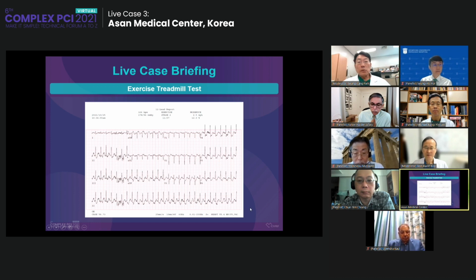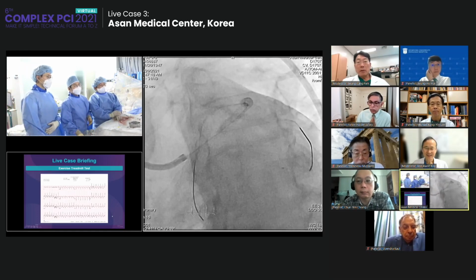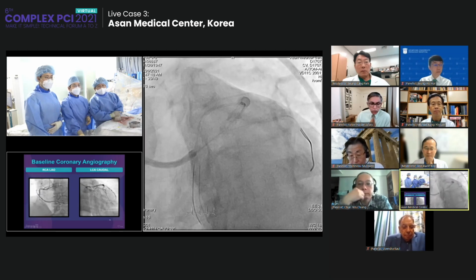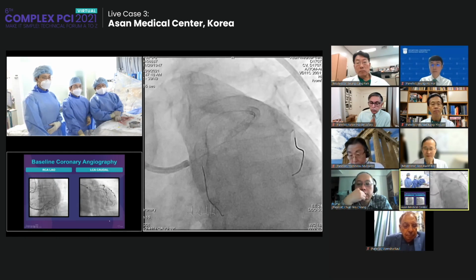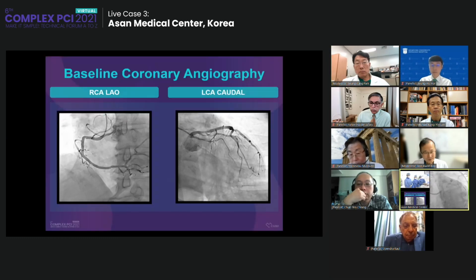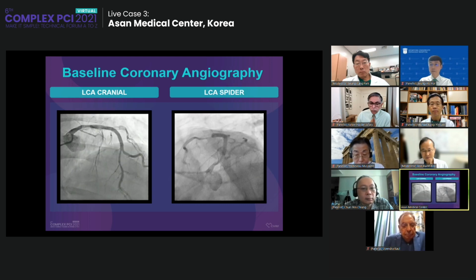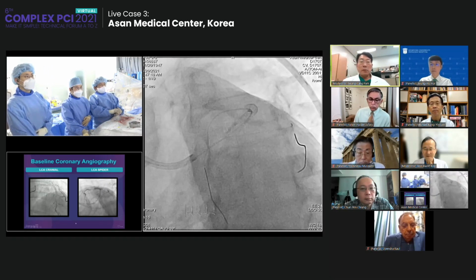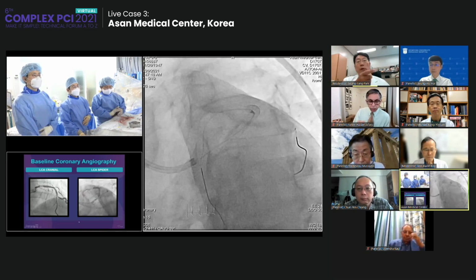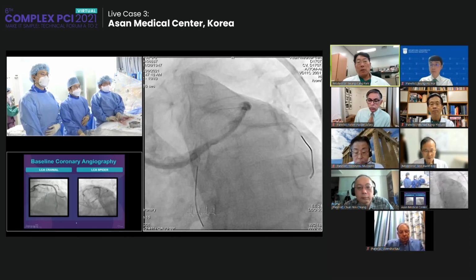Strong positive. Yes, stage two, very strong. Right, very large area of ischemia. Yeah. And could you show us the coronary angiogram again? Yes, angiographically, the intra-stent looks fine. So the stenosis looks intermediate in the left main to proximal LAD and the distal stent. So how to treat this patient? You are concerned about the tandem lesion, from proximal to distal, right? Yeah. So FFR is 0.77 in the far distal part, right? Right. And just above the stent area, what about the FFR over there?